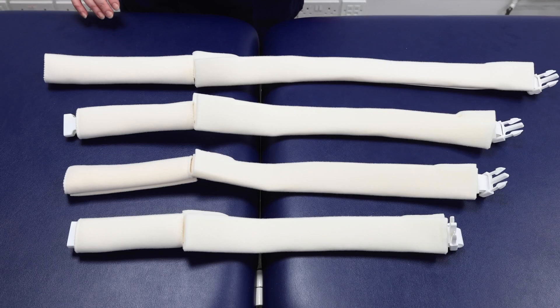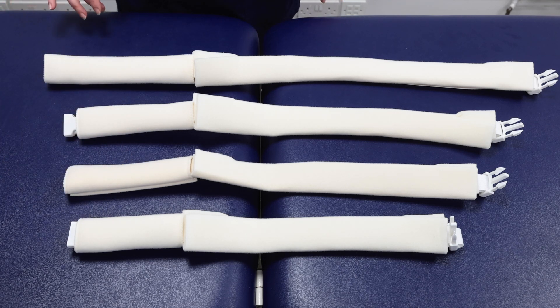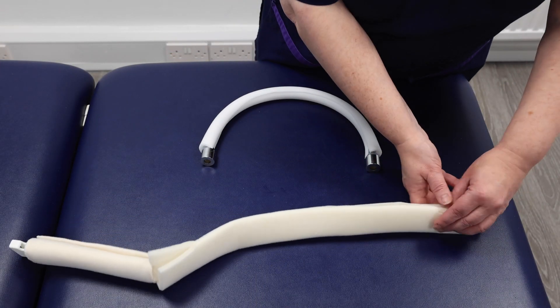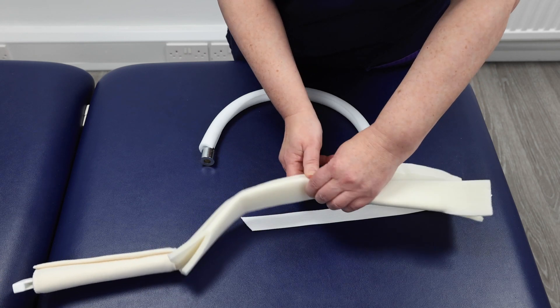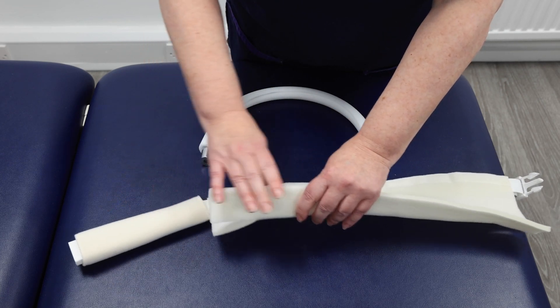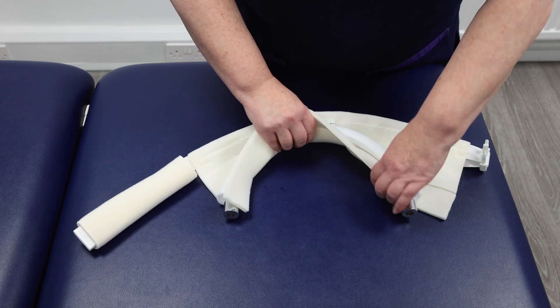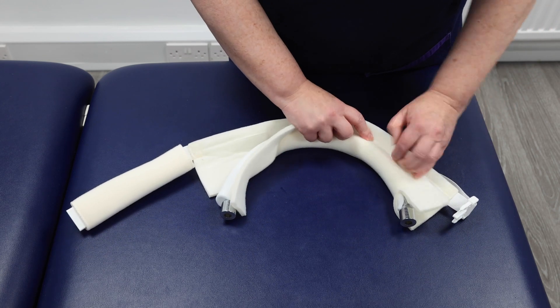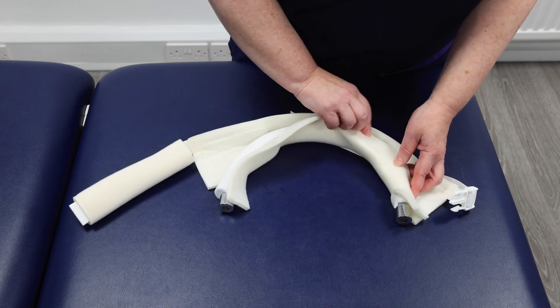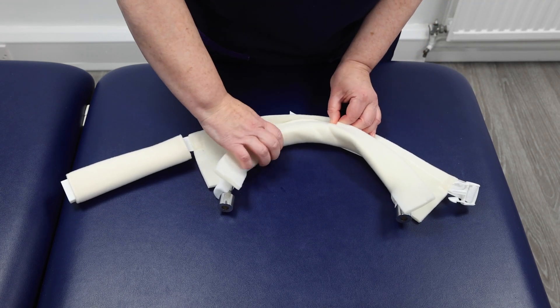Thigh hoop cover application. Choose the correct thigh hoop cover, available in large, medium, small and extra small — here we are using a large. Undo the hook-and-loop fastener and leave the smaller bar untouched. Smoothly cover the top of the ring to protect the patient's skin, ensuring no wrinkles or bumps. Adjust as necessary to ensure full coverage.